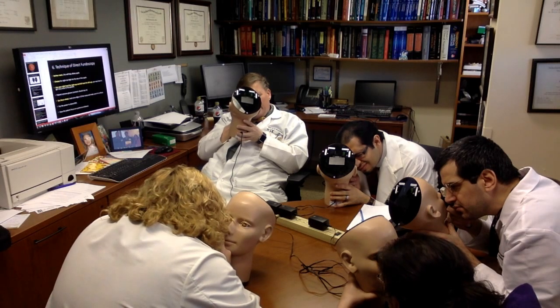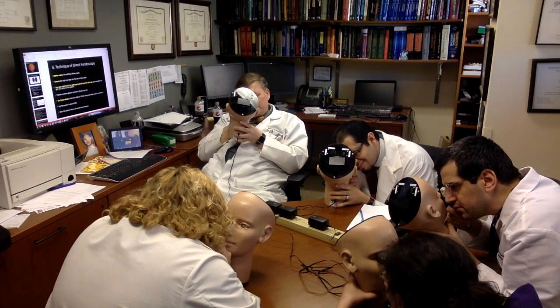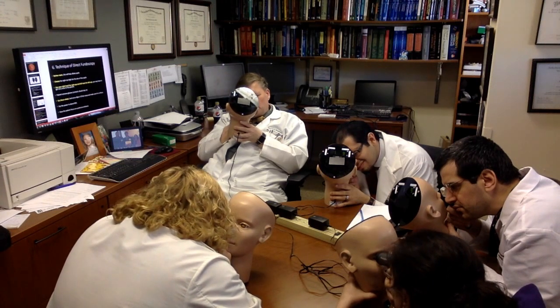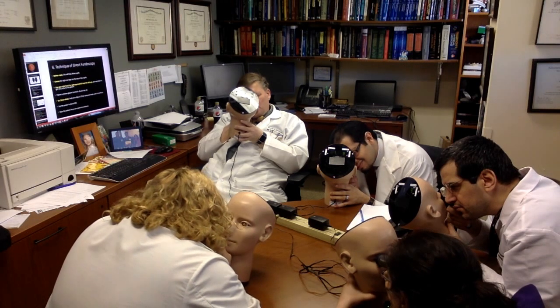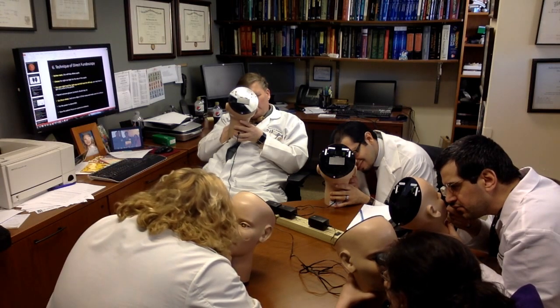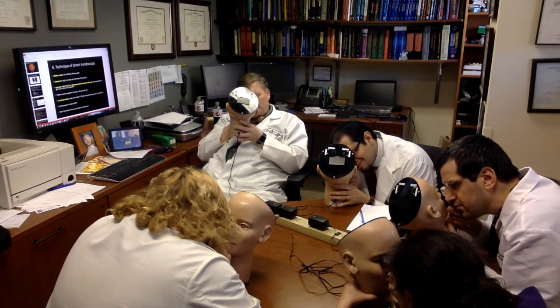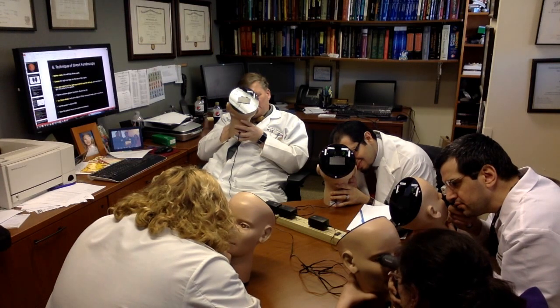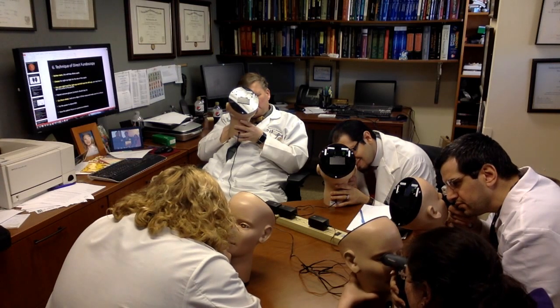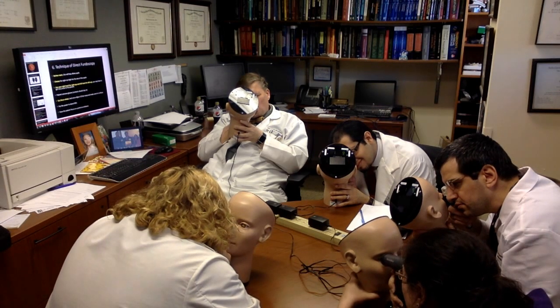Okay, good. Now, if you start to look around the retina and look slightly to the left of the disc, you'll see especially those blood vessels going up and over, down and under. And if you look directly in the center, you'll see an area of the retina where the blood vessels are kind of surrounding, which is more pigmented. Do you see that? All right, that's the macula. If you look closely, the blood vessels come pretty close to it, but they don't cross the macula because the macula gets a lot of its blood from behind, from the choroid.